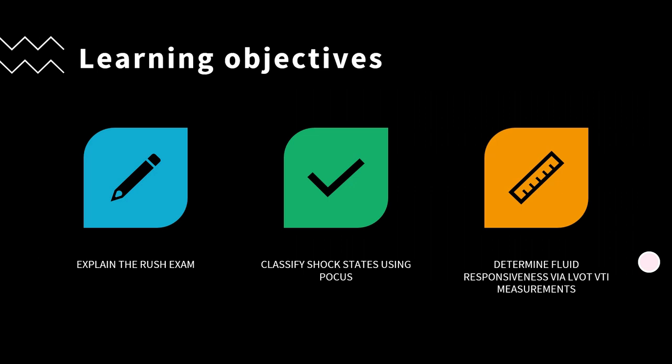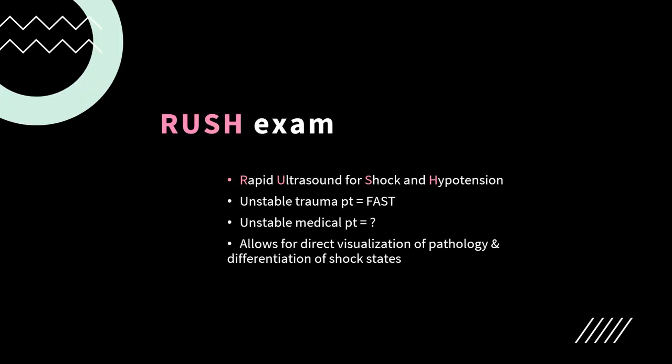I have three main learning objectives. First, to describe the RUSH exam, then to identify the shock state using POCUS, and finally, to determine fluid responsiveness using the LVOT-VTI measurement. I will first describe the RUSH exam. RUSH stands for Rapid Ultrasound for Shock and Hypotension.